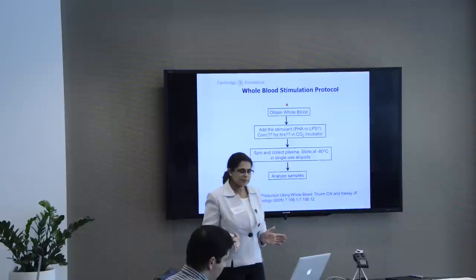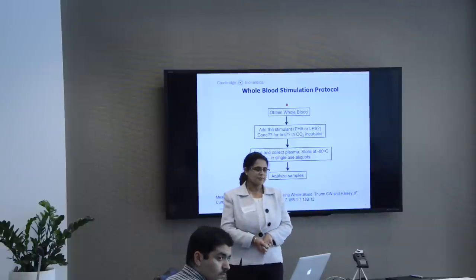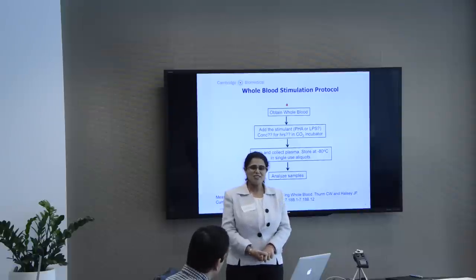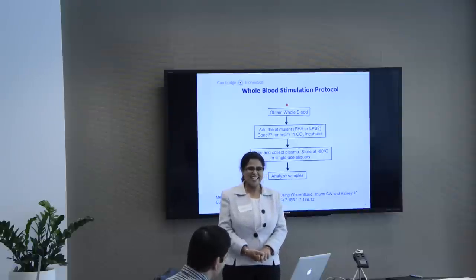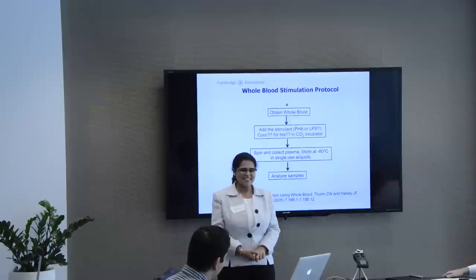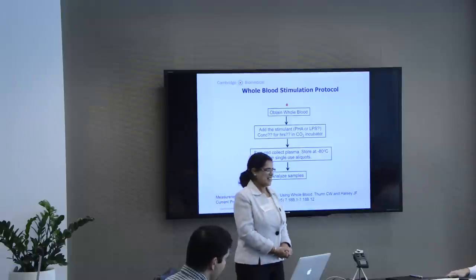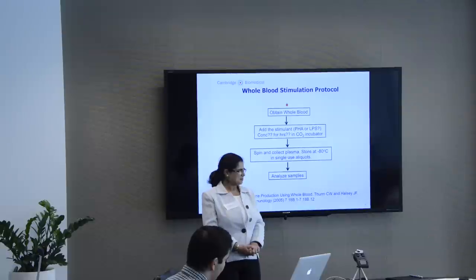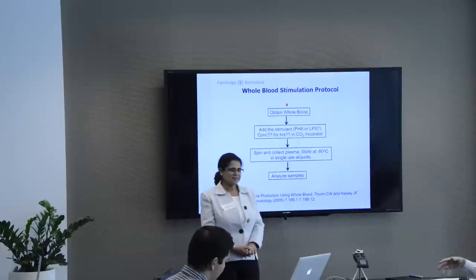But what's your suggestion for those that are not inflammatory cytokines? How do you get the natural control? We are looking for the answer too. If you get one, share it with us. Yeah, and that's the problem. Just as Dan said in his talk, some of them were active for a year with no diminution of activity, whereas other ones fell apart.